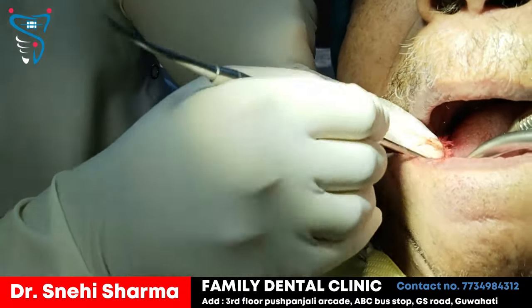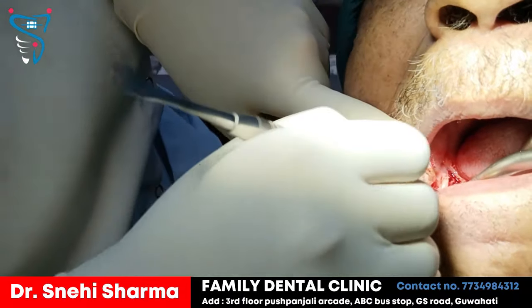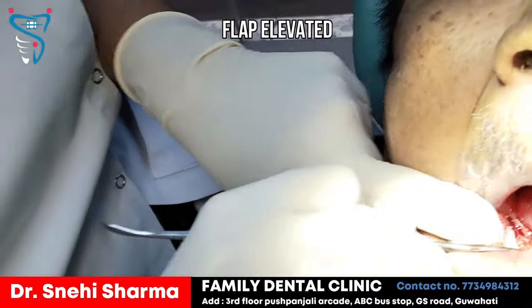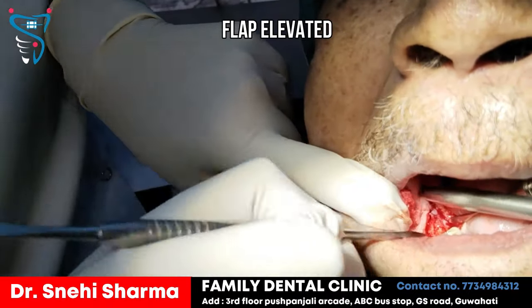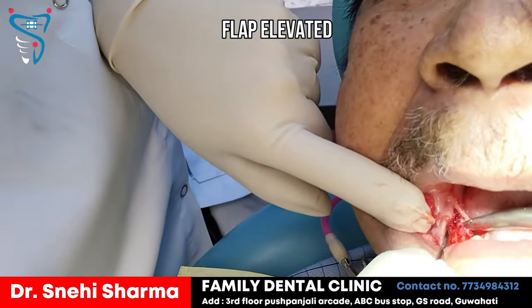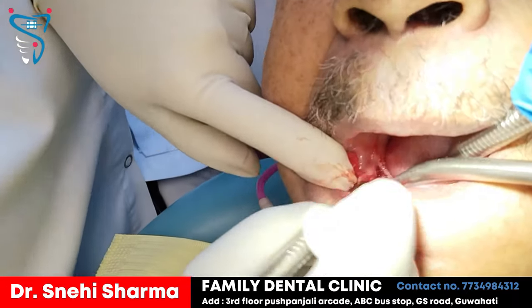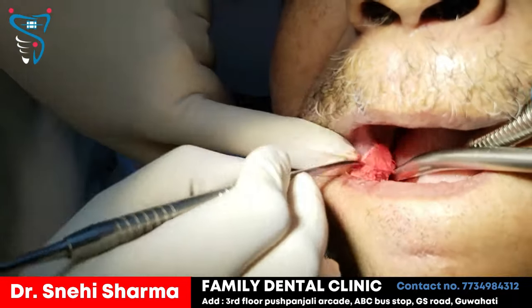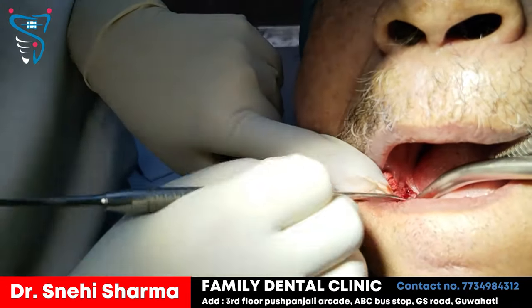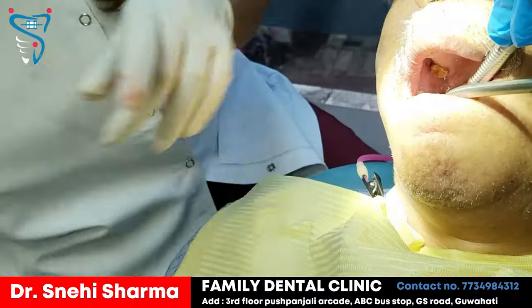So now if you can see, we've already opened up the flap. We'll now place the dental implant and start with the drilling.